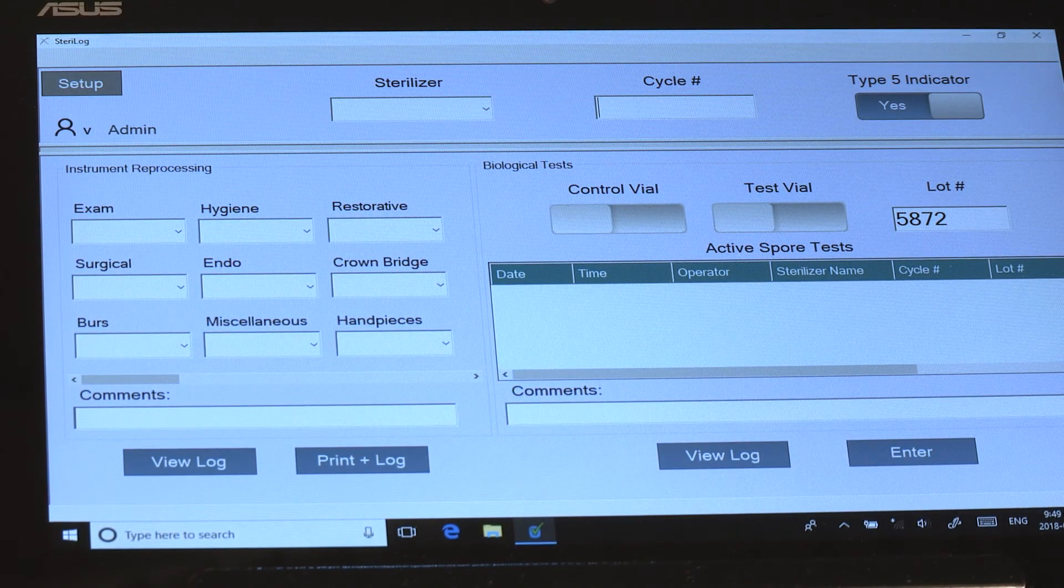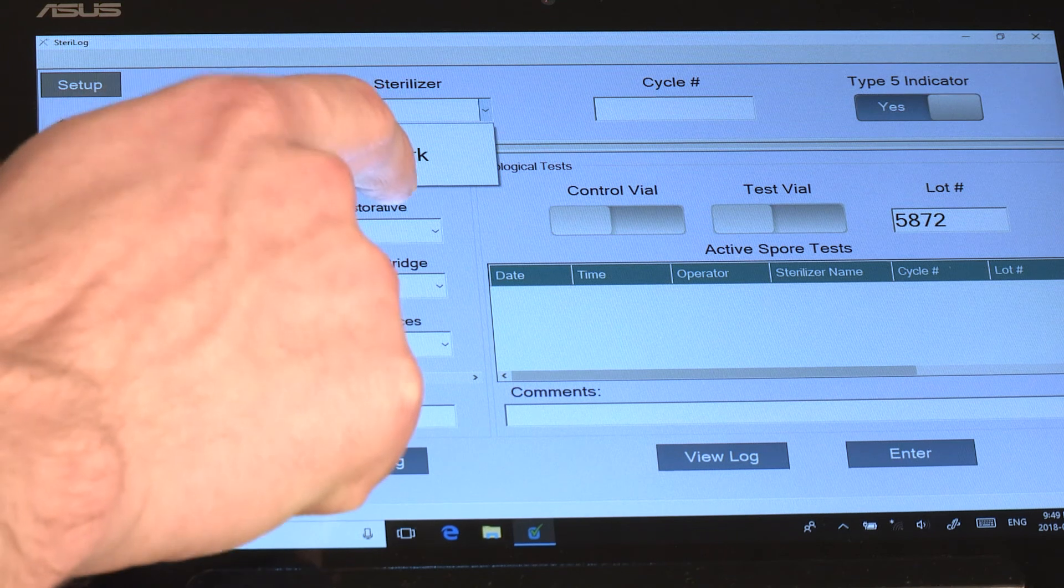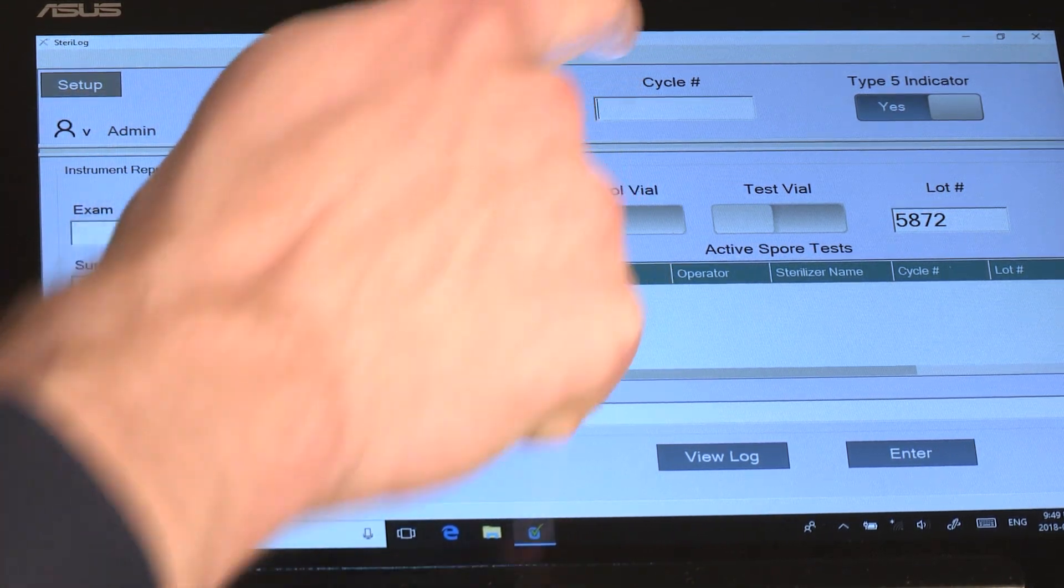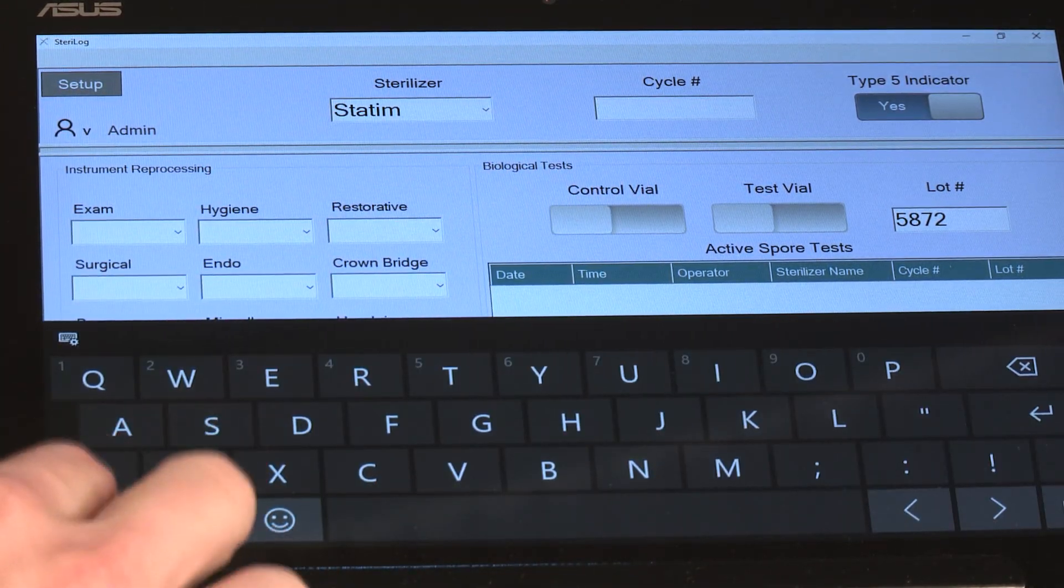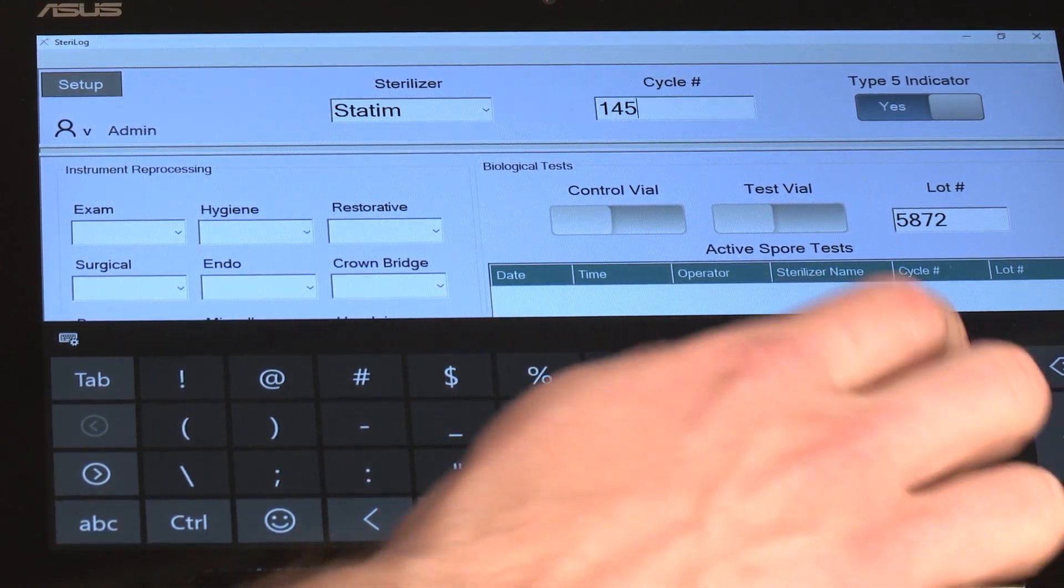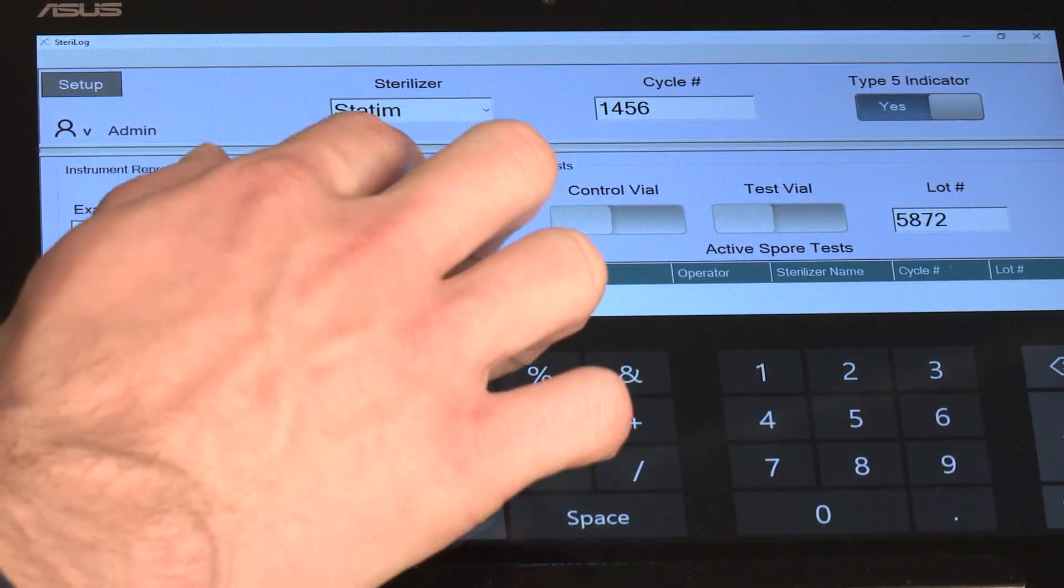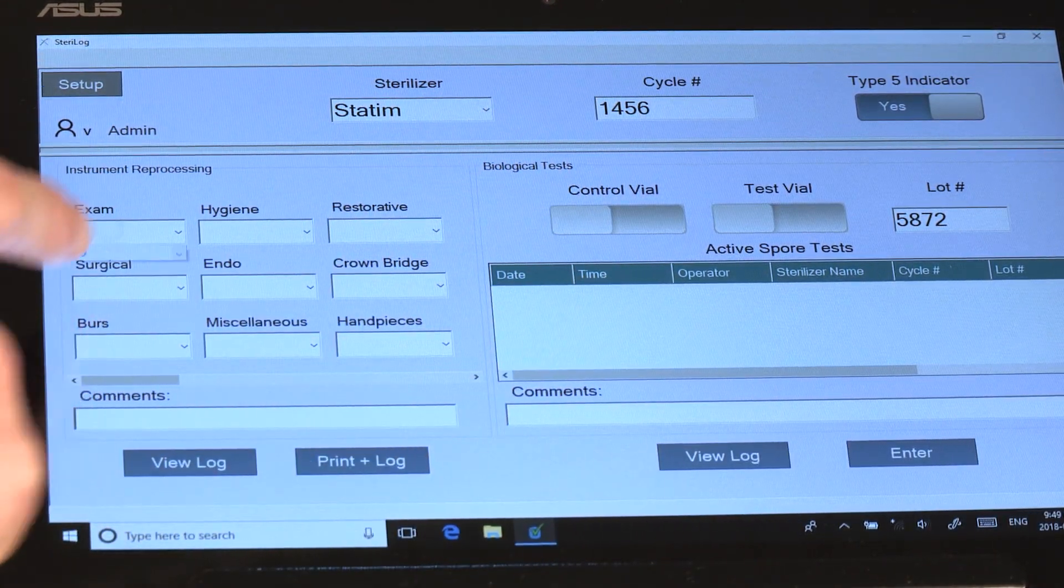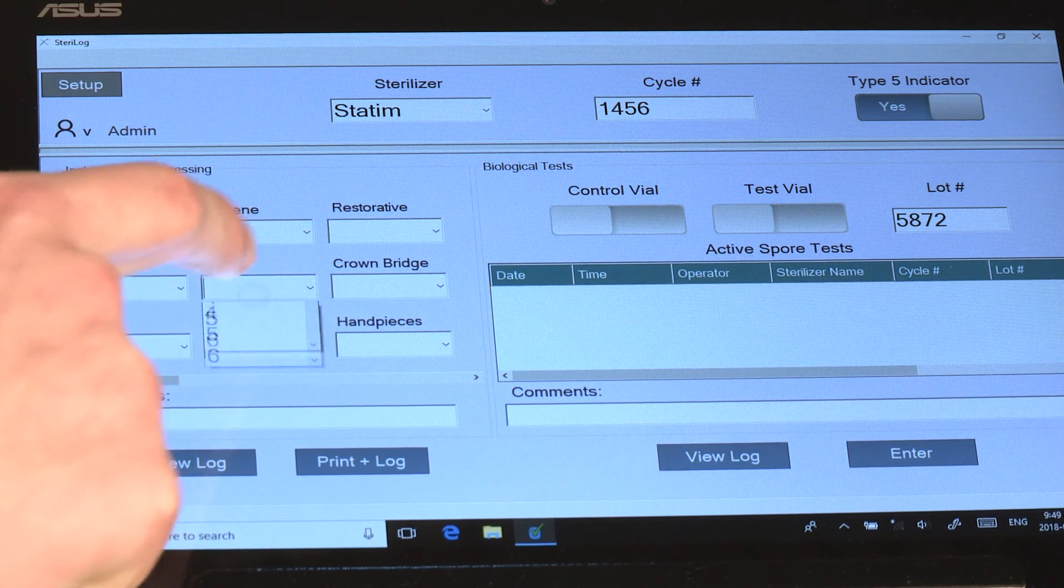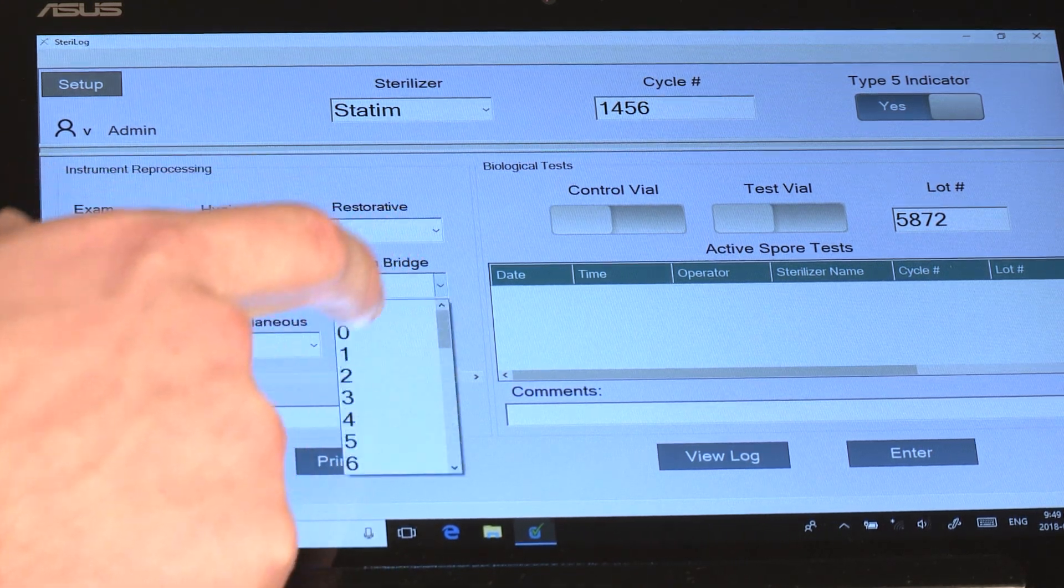To set up your first load, you would select the sterilizer and for the first time you would key in the existing cycle number.